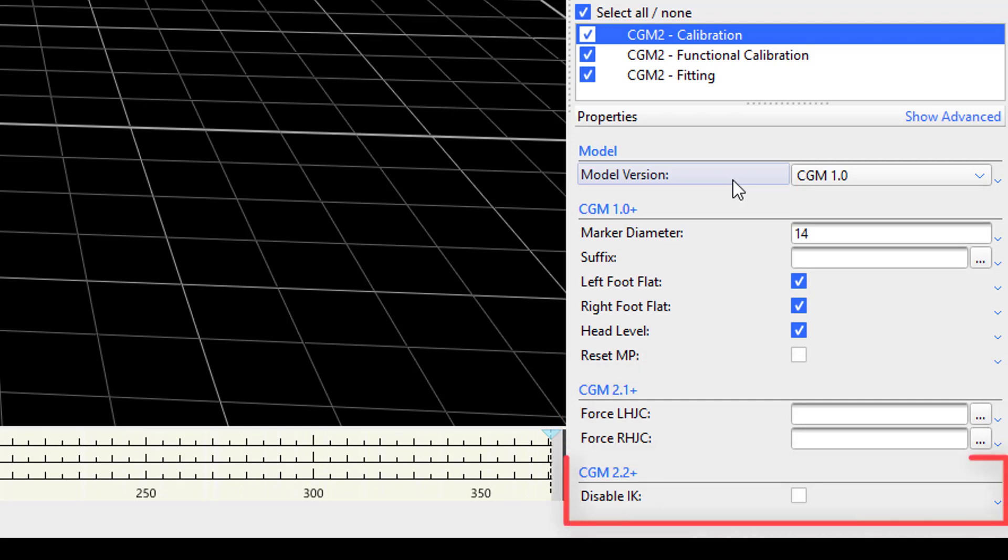In the last section, CGM2.2 plus, a user can designate whether to disable inverse kinematics. Disabling this property will use direct pose estimation to calculate segment orientations instead of the IK model.